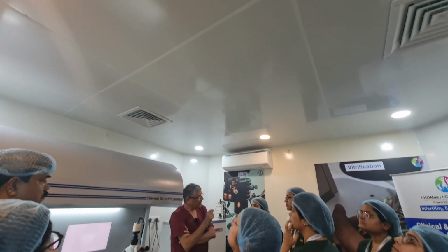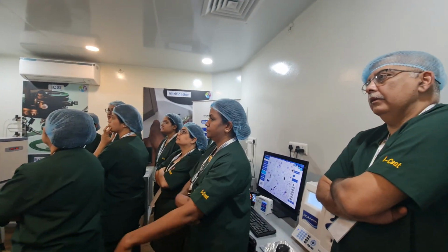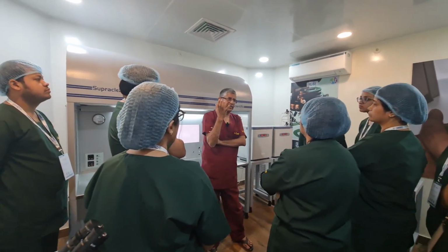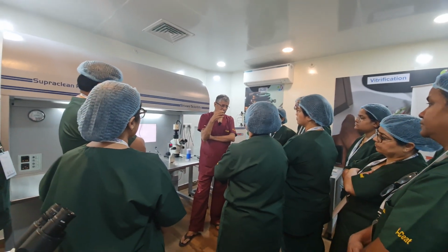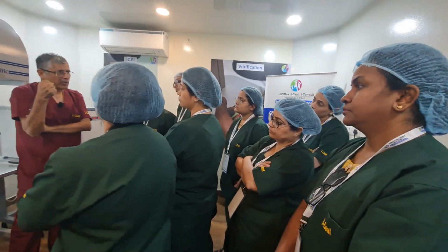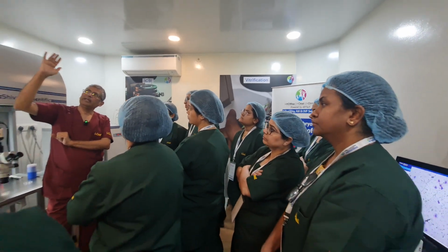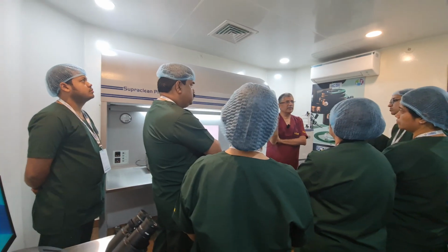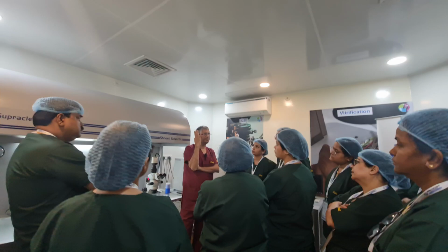So what we said in the morning, that we should not have a ceiling which is made up of gypsum. Gypsum is harmful. Gypsum is not bad, but what is gypsum? Gypsum is basically some element of calcium silicate or cement. It has also got some amount of paper element to it. So gypsum will always gather moisture. It may become wet later. So we want something which is not wettable easily, which we can clean. So you can use either stainless steel or you can use ACP sheets. This is aluminium composite panels.